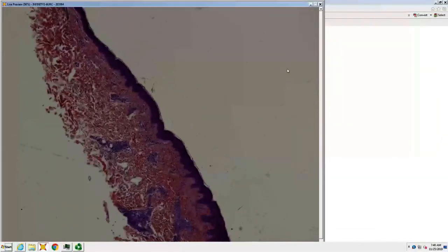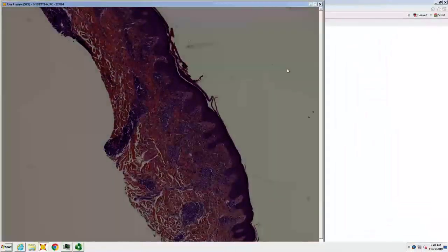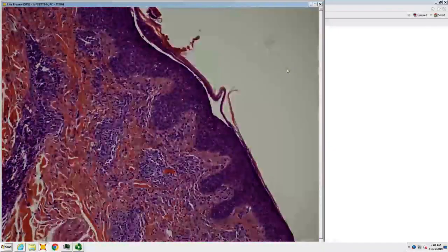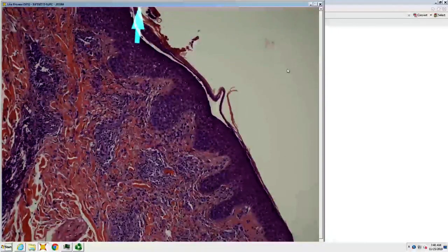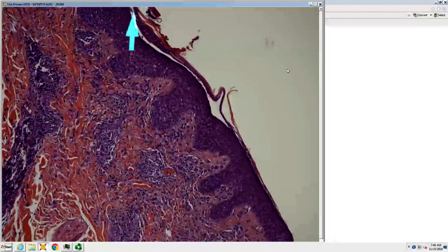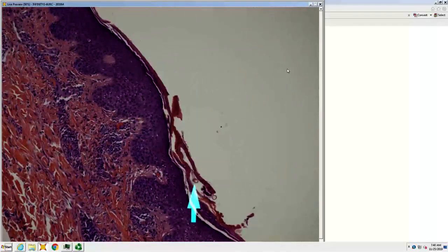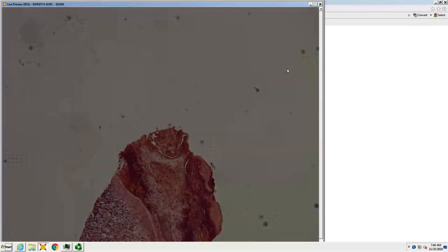Lots of inflammation in the dermis. Mostly lymphocytic. Scabies. So you see the little popped ova in the corneum, and even though we are doing virus today, don't forget scabies. The things you will miss in your career. Tinea, scabies, they will make fools of you many times.